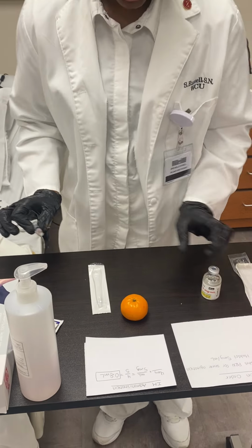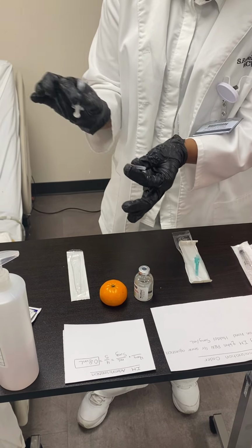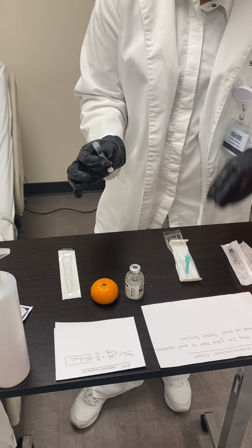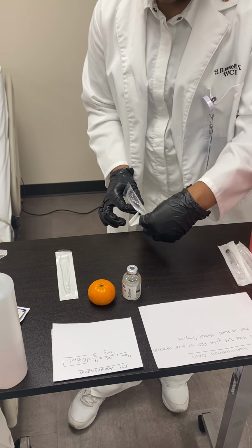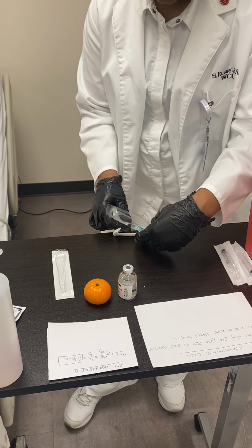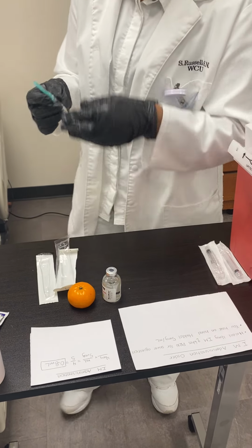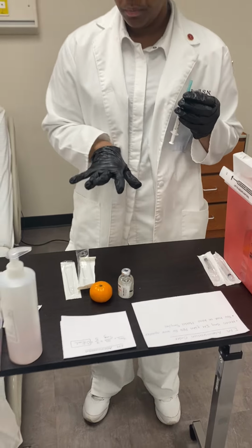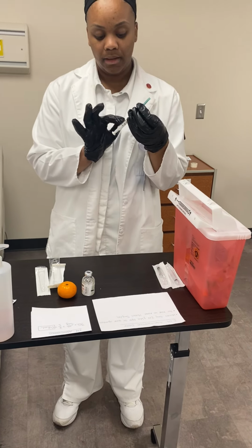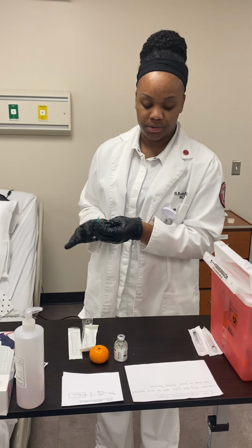Recap the needle, and at this point, I'm gonna go ahead and twist that top off, put that into the sharps container, and I'll go ahead and screw on another cap. And this is the same gauge needle, 22 gauge. And okay, if I'm preparing all this medication before I go into the patient's room, I'll go ahead and initial the syringe, and then I will check this with another nurse.